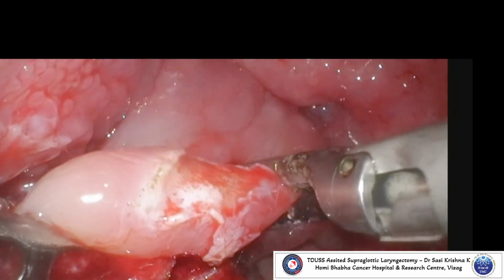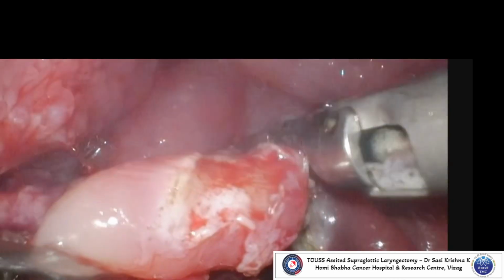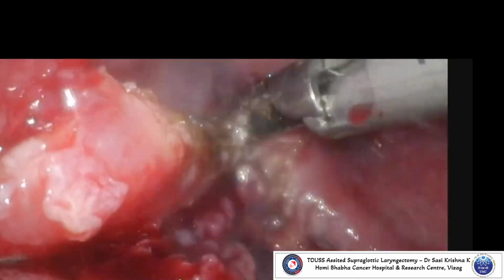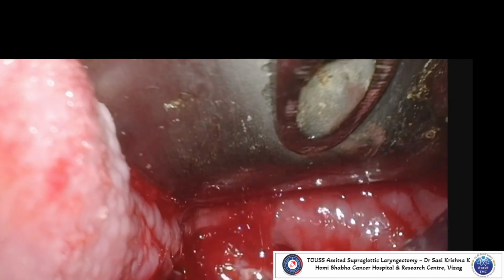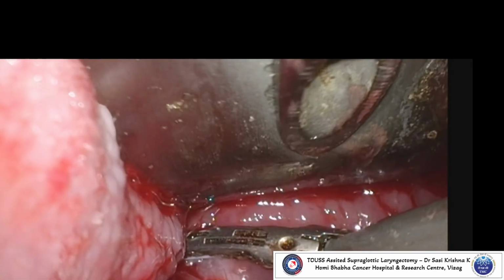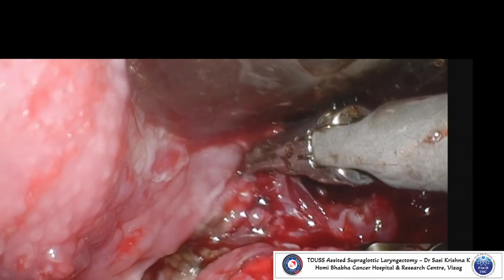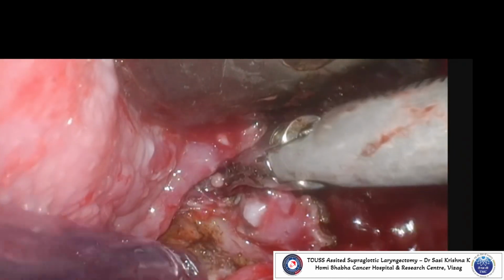Now the cuts are made through the epiglottic cartilage. Even cold instruments like scissor can also be used for this purpose. Now the mucosal cuts are being made at the junction of base of tongue and vallecula. Exposure to this area can be improved by performing various maneuvers like withdrawing the tongue blade, external pressure over hyoid, and good counter traction over specimen using a suction or a grasper.